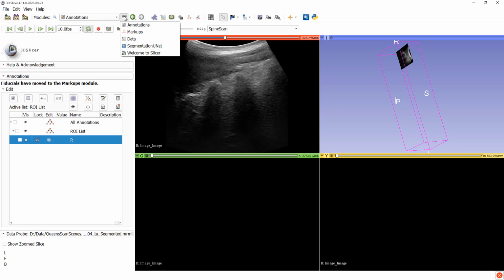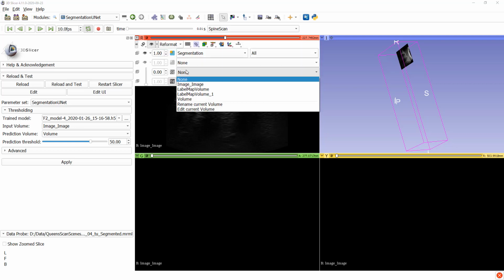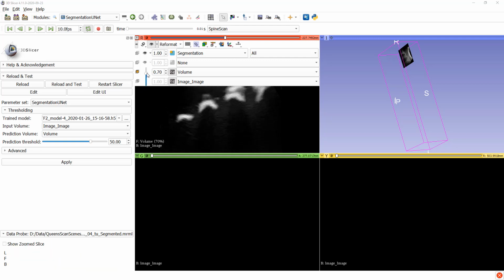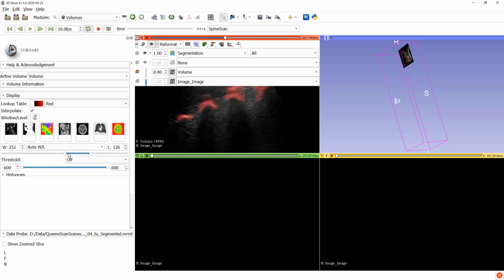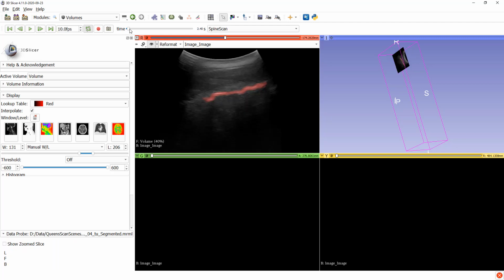Here I'm hiding the region of interest. We don't need to see that anymore. And now that we have applied the U-Net module, we can again set up the overlay between the ultrasound image and the prediction image so we can see them both at the same time. But for best visualization, we will switch to red color in the prediction image. These are standard image viewer options that work with all imaging modalities here.